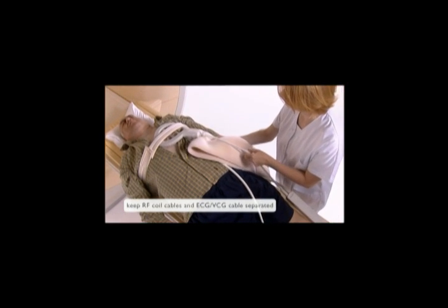Precautions are needed to avoid the occurrence of RF burns, such as local skin reddening or blisters. Unfortunately, apart from the receive coils, resonant induction loops can be created accidentally. These may act as additional unwanted RF antennas. Electronic RF filtering is applied to prevent cables and other components of RF receive coils becoming part of potential unwanted antennas.